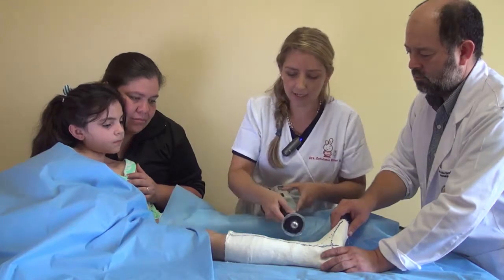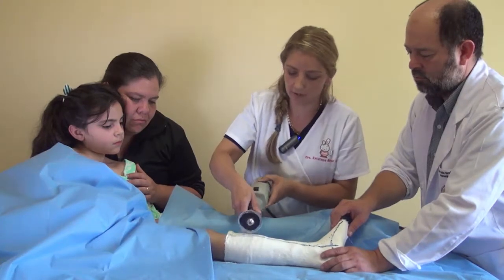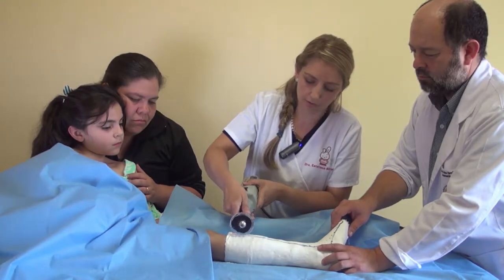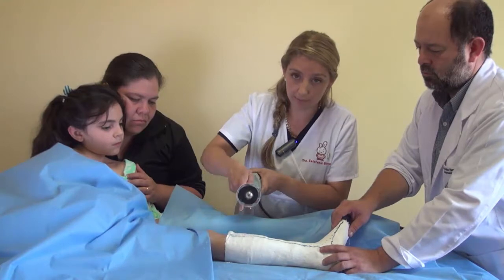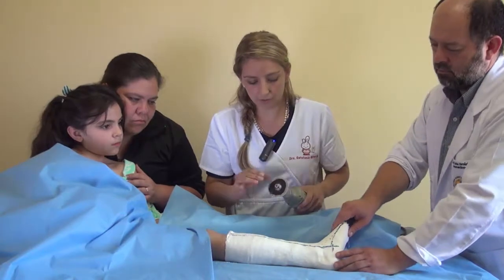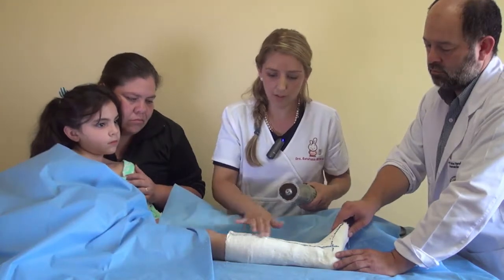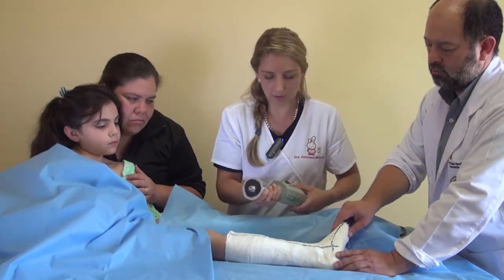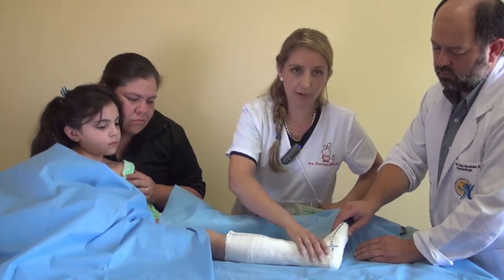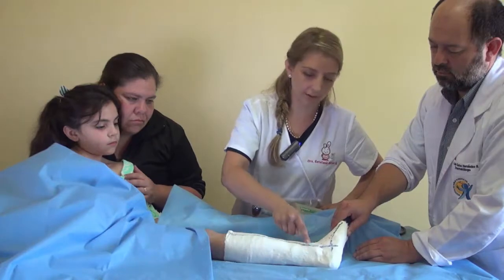The cutting technique is not a sliding motion but rather pushing in and pushing out — pushing in, pushing out. Use your finger to help hold the machine because it's heavy and you can slip down and hurt the patient. You also have to take care of the temperature of the saw because it gets very hot from cutting the cast. Then, in this particular zone around the ankle, you have to be careful of the ankle malleolar eminence.